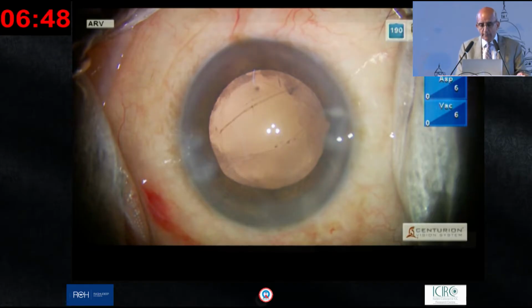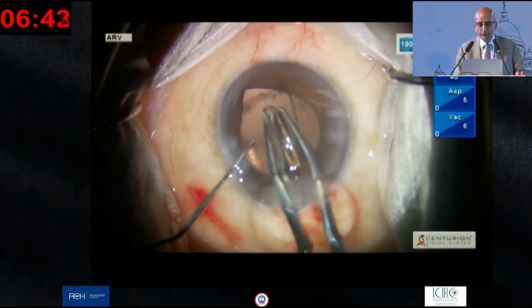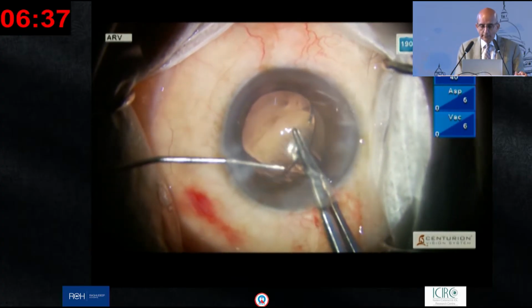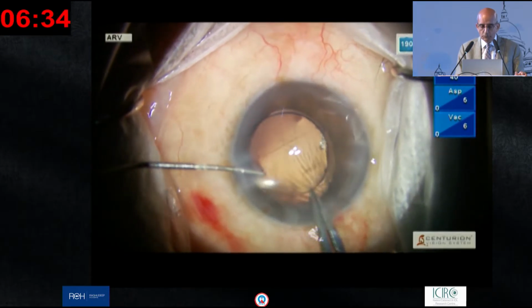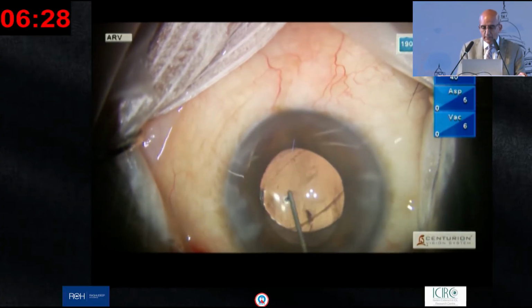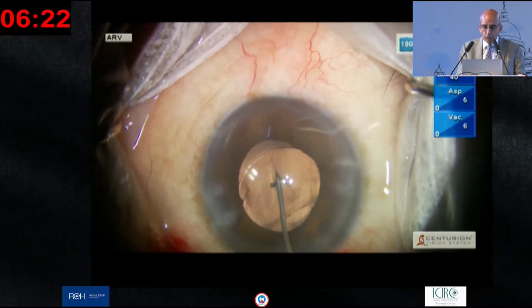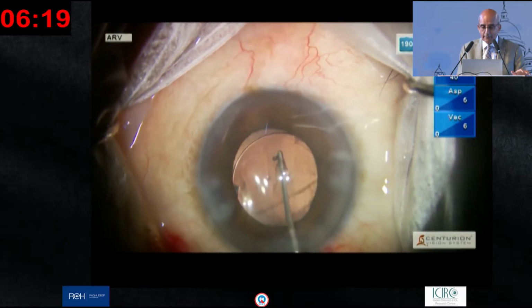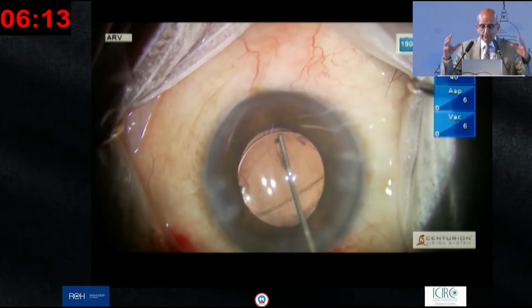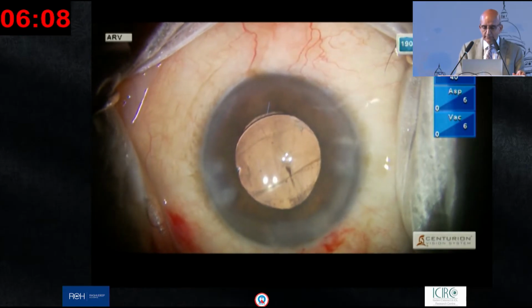So then the consideration would be a 3-piece IOL, haptics going underneath the iris in the ciliary sulcus in front of the anterior capsule, and then I'm not dialing it, but I'm using the McPherson forceps to put that trailing haptic underneath the iris. Now I'm nudging the lens in such a way, pressing it towards the retina, that the entire optic goes posterior to the posterior pre-existing tear and also the anterior capsule. So both of these are holding the lens. I'm capturing through both posterior capsule and the anterior capsule, and the lens is quite stable.